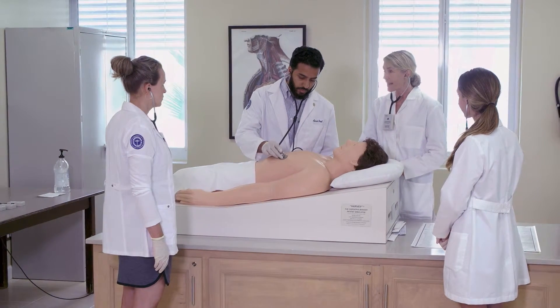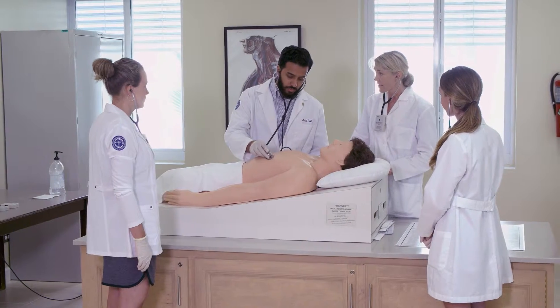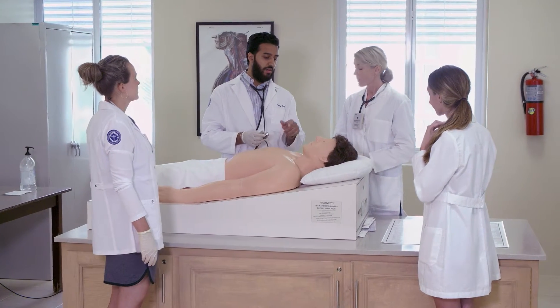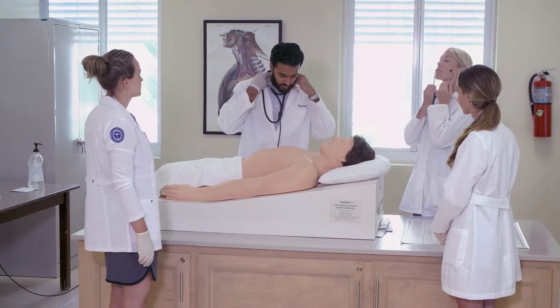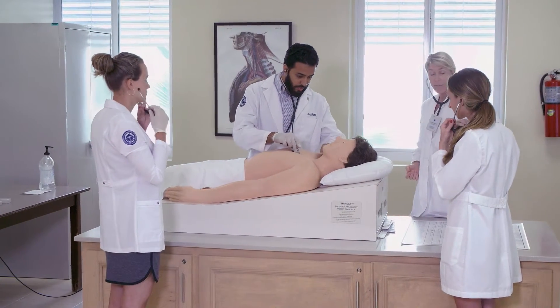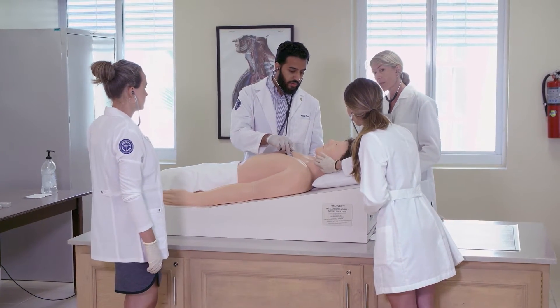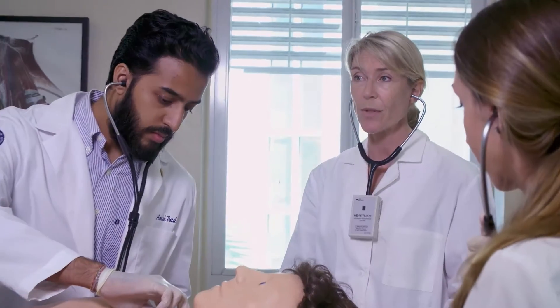Now how are you going to decide if that is a systolic or a diastolic murmur? Amrish, how are you going to decide that? According to the carotid. Excellent. So ladies, you can palpate too. Julia, you can palpate and tell us — just one side at a time. You can hear it up in the carotid — it's radiating up into the carotid.